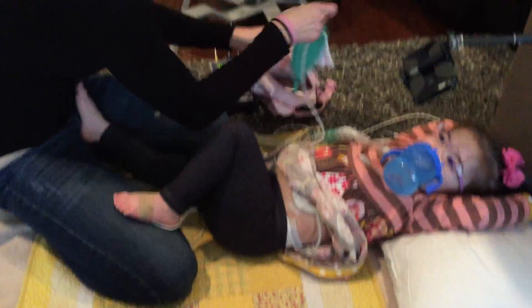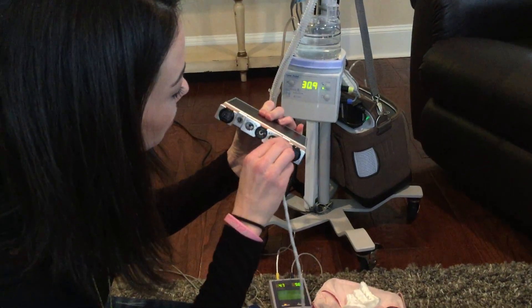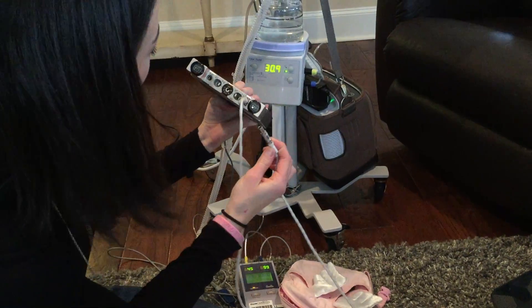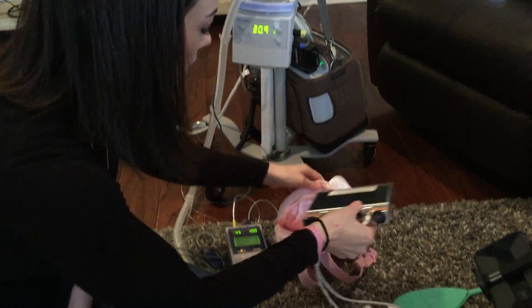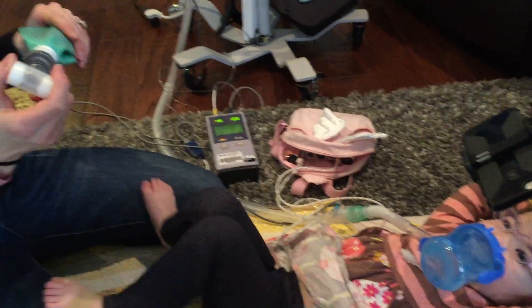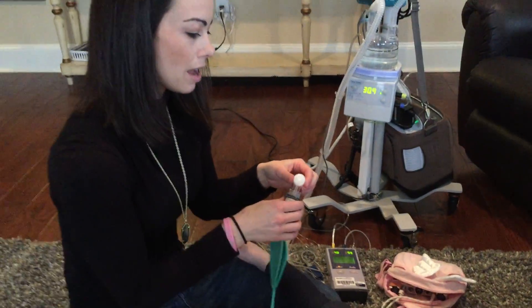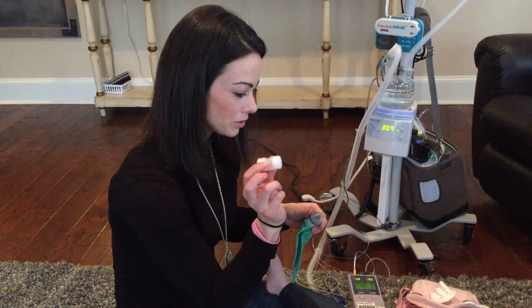You match this up on the transmitter box — you want to see the right side, which is right here, and you plug it in. Then here's the left, so I'll plug in the left. This is all ready to go in the backpack. We just had this test lung so I can plug it onto the circuit as I'm turning on the pacers, just so the vent doesn't constantly alarm.